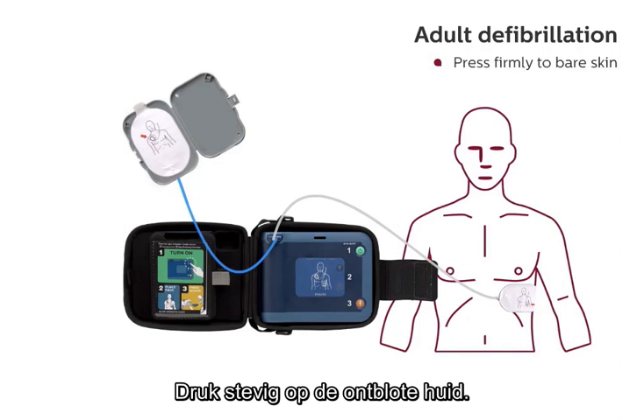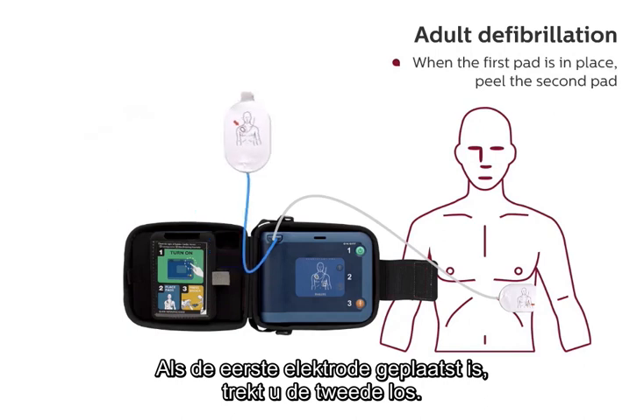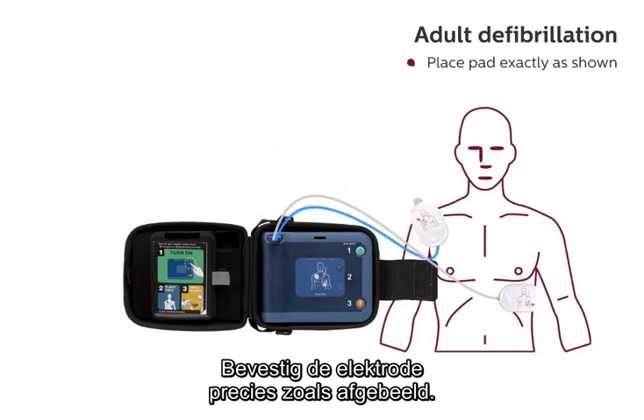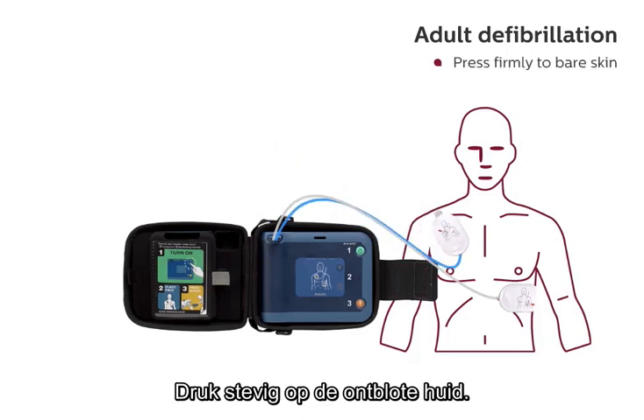Press firmly to bare skin. When the first pad is in place, peel the second pad. Place pad exactly as shown. Press firmly to bare skin.